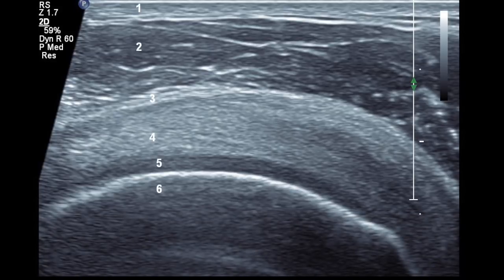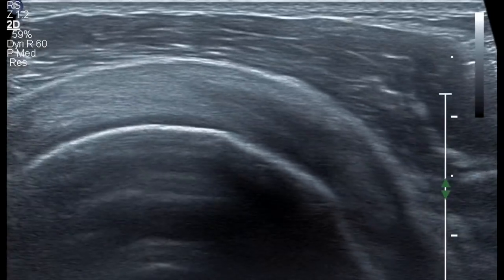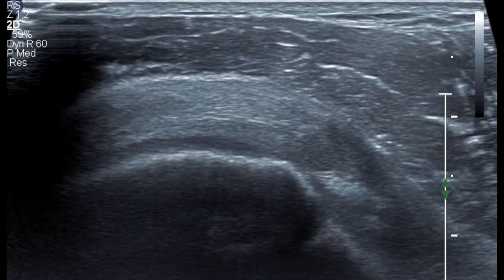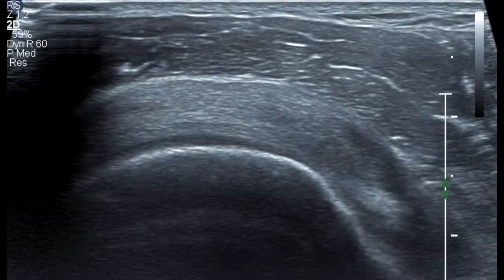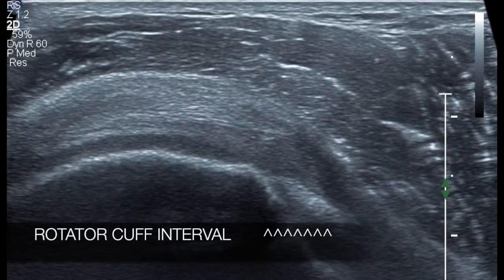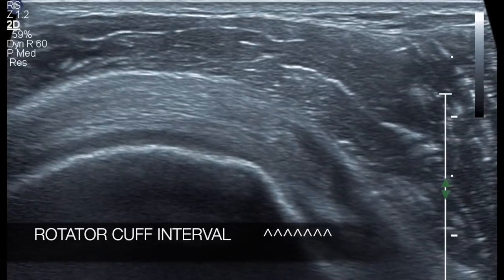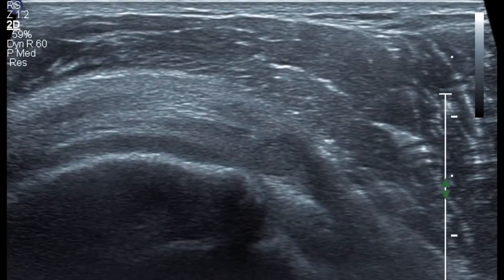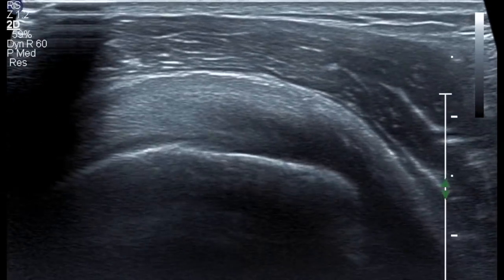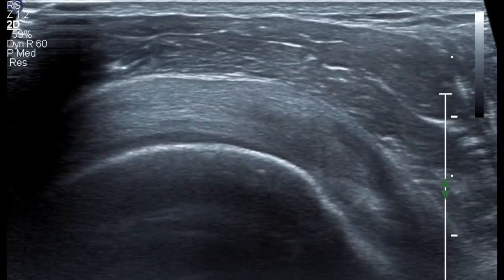You have to appreciate all six layers in each and every patient in a transverse view. As you move more medially in the transverse view, you will appreciate the rotator cuff interval where you see the biceps tendon end-on. This is the site which most arthroscopists use to enter the shoulder joint, and your supraspinatus tears have to be measured in relation to the rotator cuff interval.